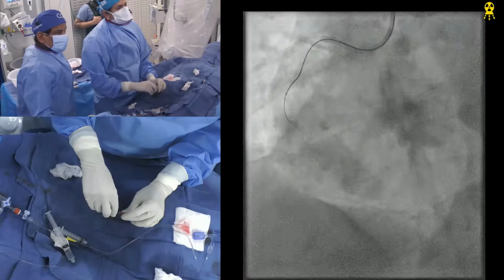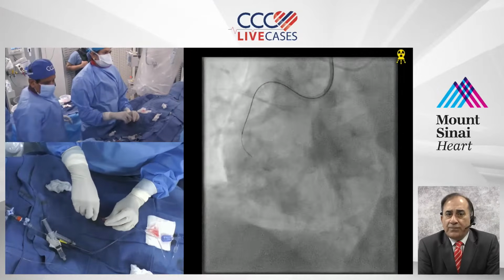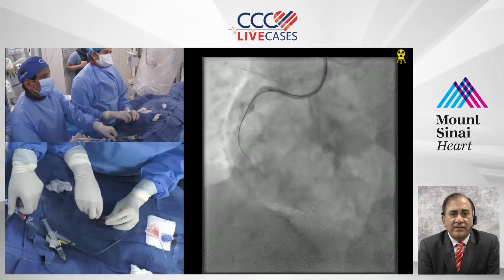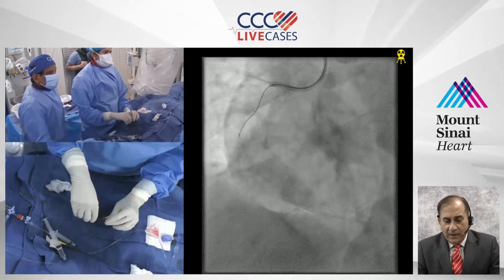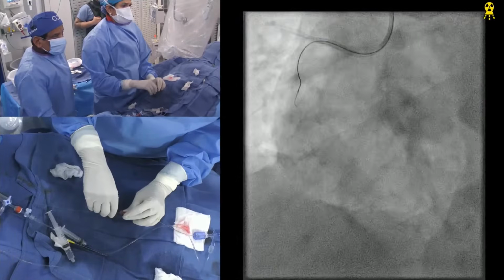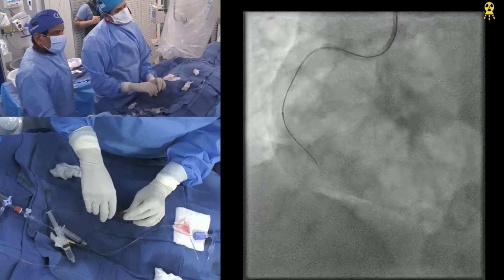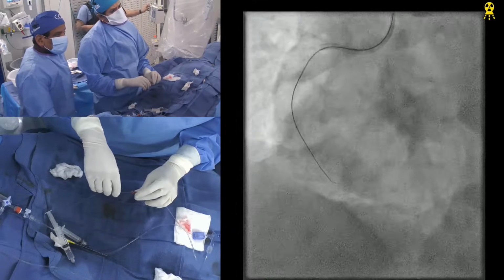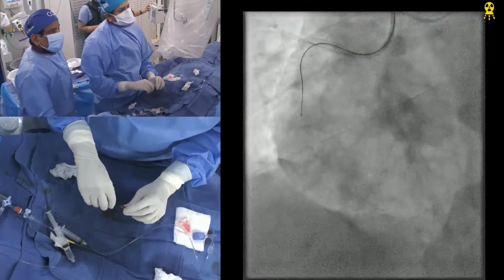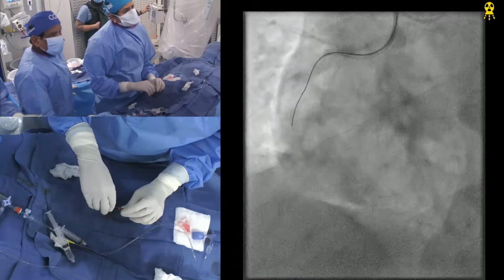I think you're already with the microcatheter already in the, not sure. Now see a little more. No PVCs here. It should be going easily. Yeah. Give me the Hornet. Otherwise, then we go to the. Yep.